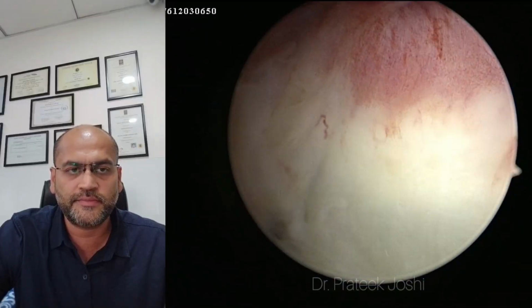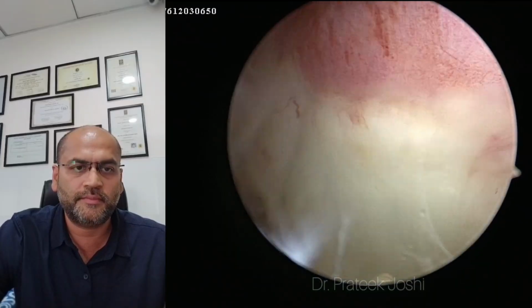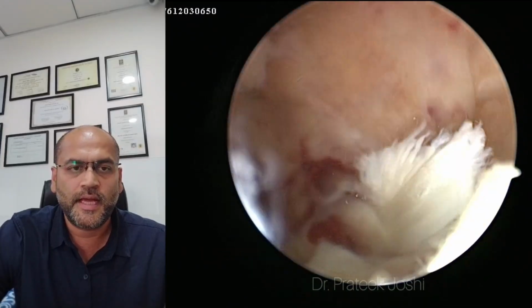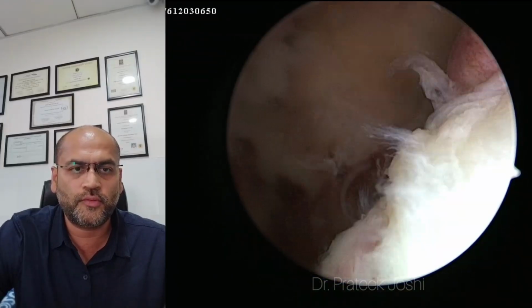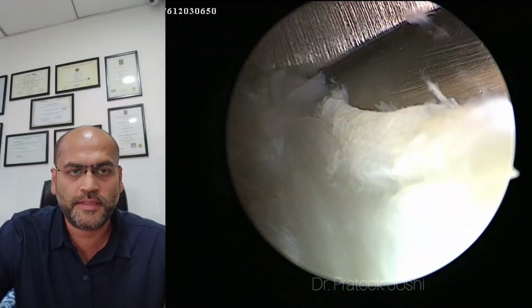As you can see, I am seeing through the anterolateral portal of the knee, and I have inserted my probe from the anteromedial portal. There is a complete tear of the ACL, and what you are seeing is a torn ACL stump which we are going to excise in order to start the procedure of arthroscopic ACL reconstruction.